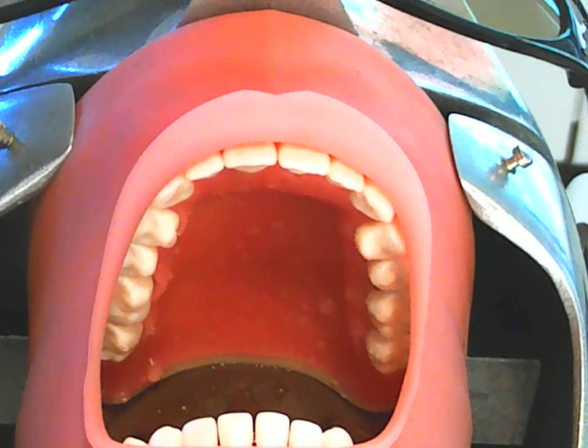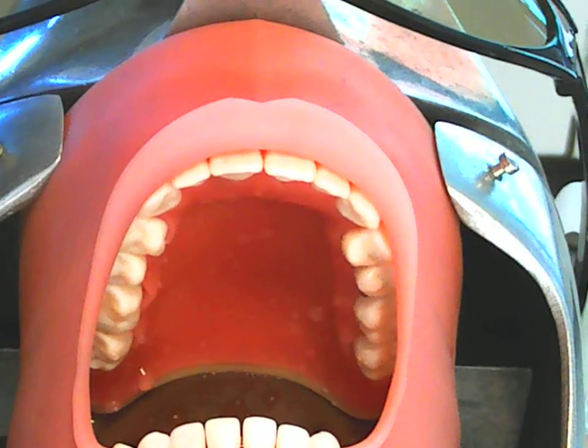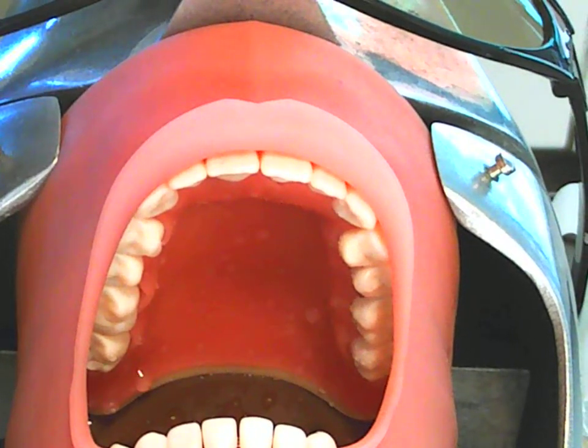Okay, so we want to ensure the client is understanding what is happening, so we're going to perform dialogue by explaining the procedure to the client and informing them that we are going to be placing dental dam on a front tooth, and have they had it before, and if they have, that's great. You can do a little friendly reminder of what's involved and receive client consent.